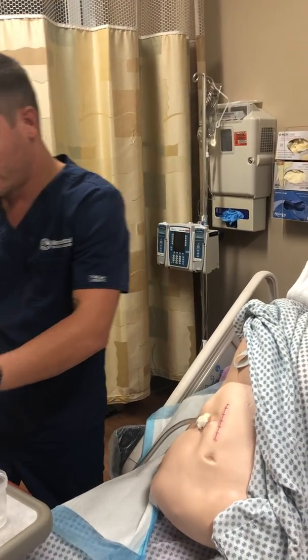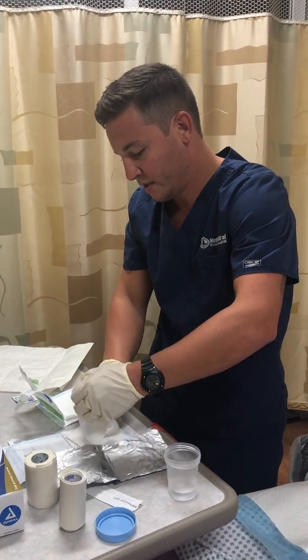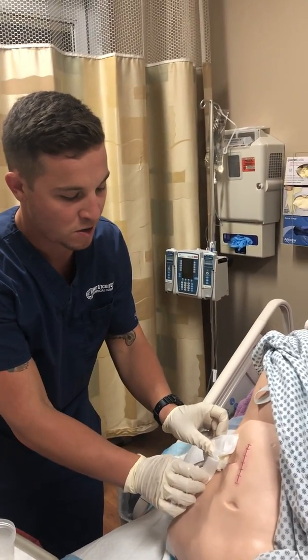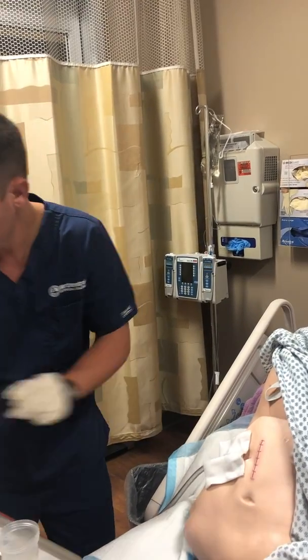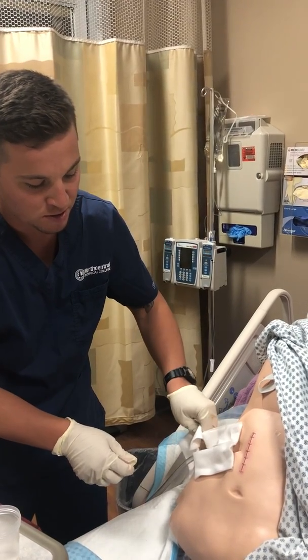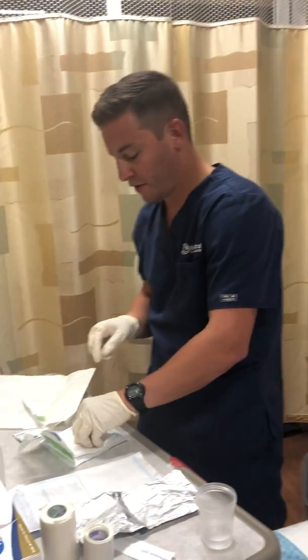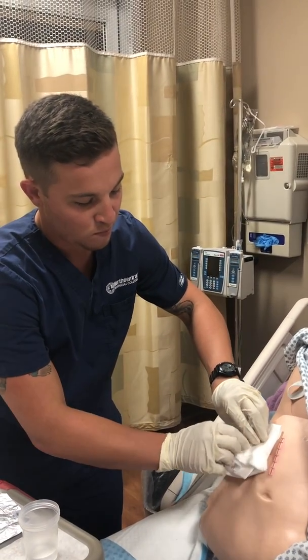Occlusive site. Okay, next we have our slotted dressings. And do one like this, remaining sterile. One. Like this, going over. Like that. And our last one here, we have our 4x4. Okay, it's going to go right over top, cover.